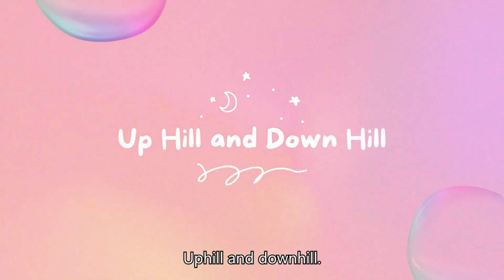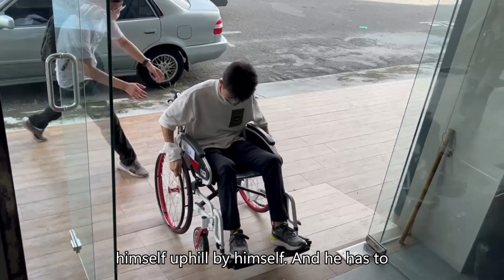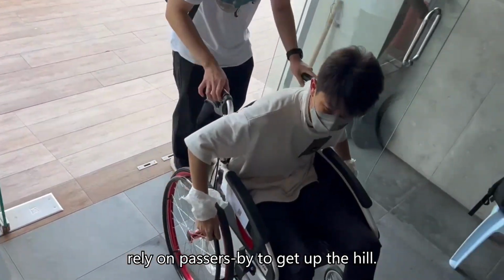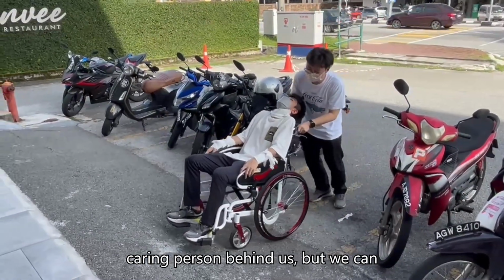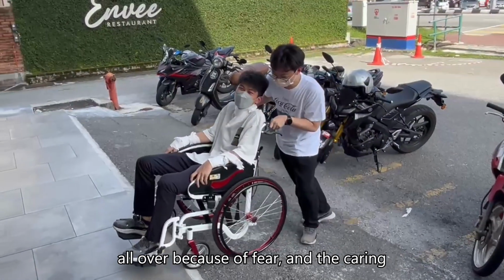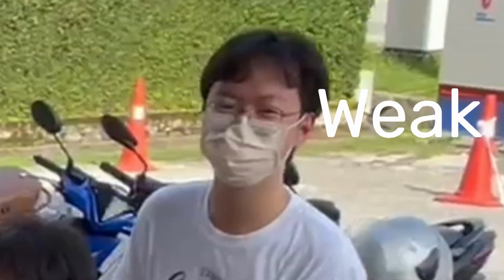Uphill and downhill. When the patient is going uphill, we can see that the patient is not able to push himself uphill by himself, and he has to rely on passers-by to get up the hill. When encountering an uphill slope with a very large angle, despite the help of a caring person behind, we can clearly see that the patient is trembling all over because of fear, and the caring person is unable to push the patient up the slope because he is very weak.